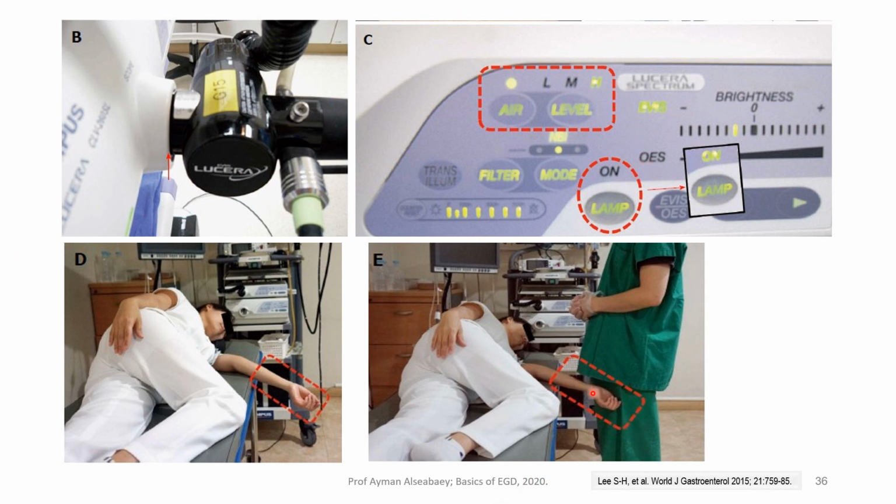This patient, we have said that the lower arm should be flexed at the elbow. Okay, so when you do endoscopy, it will not annoy you. Check that the endoscope connector is connected to the unit. If it is not pressed and you didn't hear the click, you will find that you will have no air and you will have a black image. Okay.